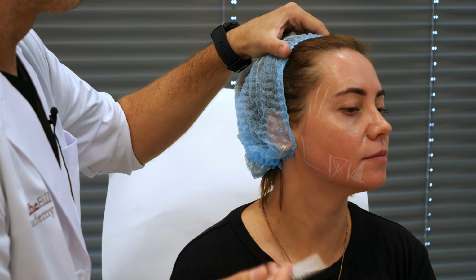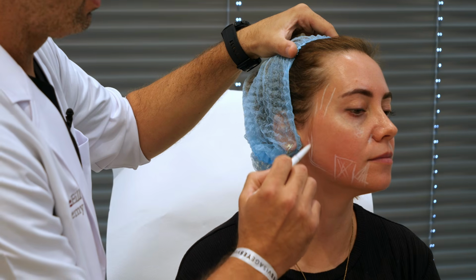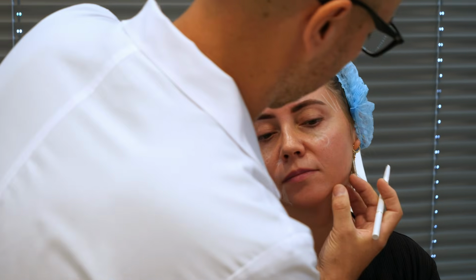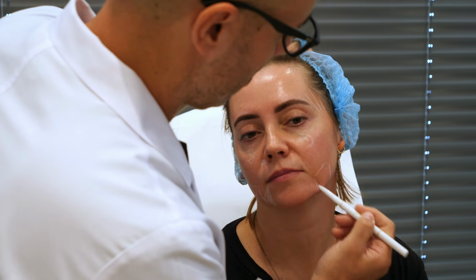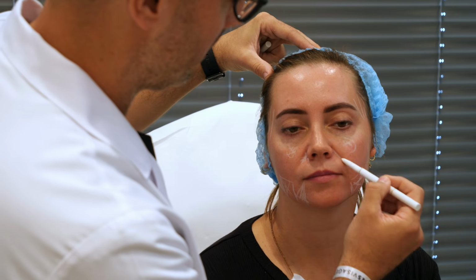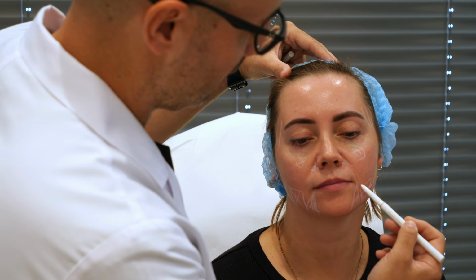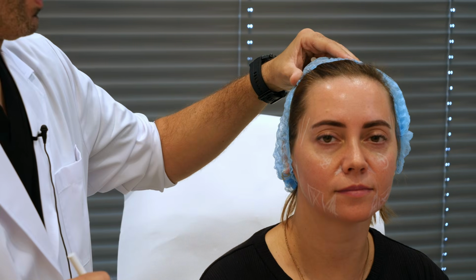And here, I don't want to put any product, okay? It's better in zones to project. This zone, not for treatment, okay? Piriform fossa on the left, and the mentalis depression on the left, okay?